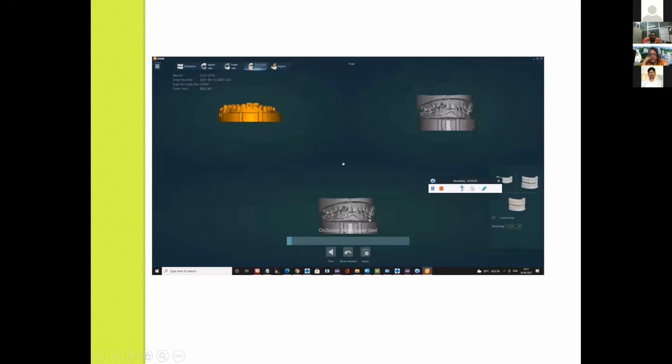If we are scanning with an intraoral scanner and not properly reaching every corner, you may skip some of the data. But there are many research papers which conclude that intraoral scanners are better in terms of getting each and every detail.